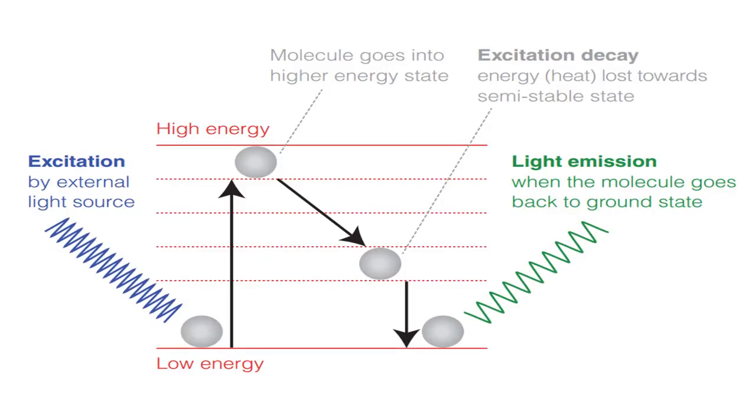Two diagnostic labels are commonly used in IHC, enzymatic and fluorescing. HRP is an example of an enzymatic label. It turns colorless substrate into a stain, thus elucidating the location of proteins in the tissue. Fluorescent tags do not require the addition of substrate.